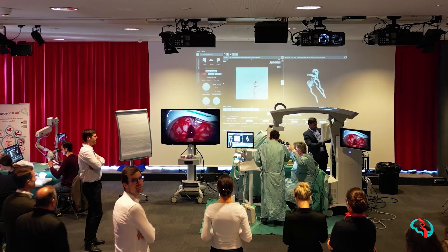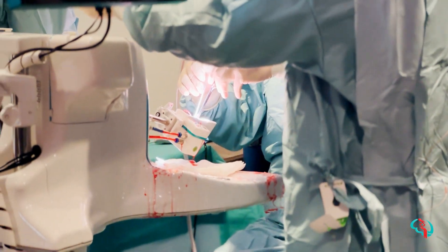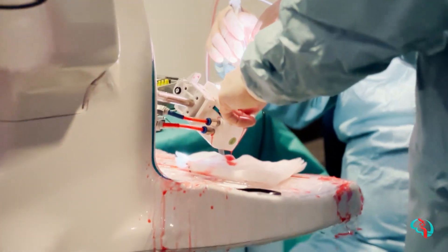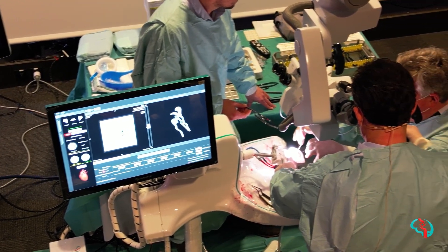I was the volunteer surgeon in this scenario. So the first thing that happens is your field gets full of blood, and we dealt with that by placing a suction — not trying to tamponade the aneurysm or put things in the sylvian fissure to tamponade the bleeding. We're trying to suck the bleeding actively, clear it, see where it's coming from.